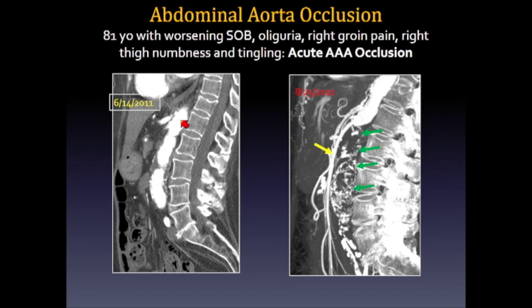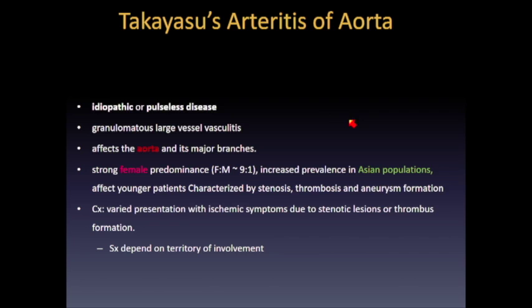The perfusion and the opacification of the aorta is normal. There is lots of atherosclerotic disease, but 2 months later, she really occluded the entire mid portion and distal portion of the aorta with SMA serving as a collateral. So these things can happen really quickly, so it's important to know that the patient has a significant PAD. Like this one had a stent already in a celiac artery and was treated previously, so this has to be very quickly, urgently managed.